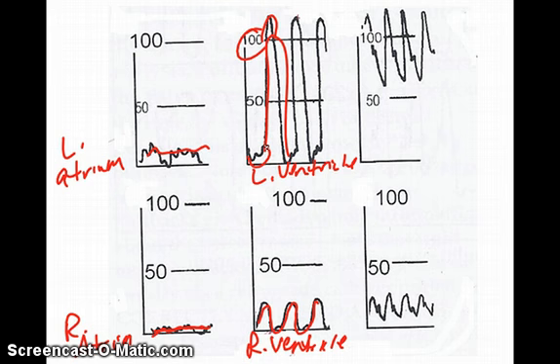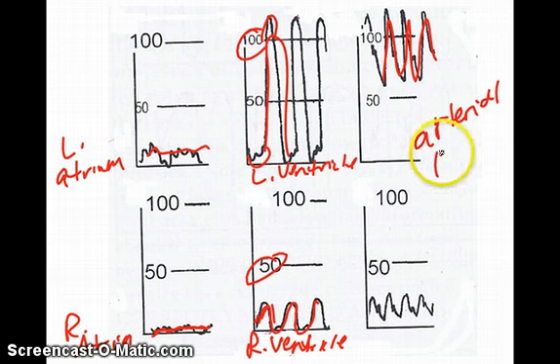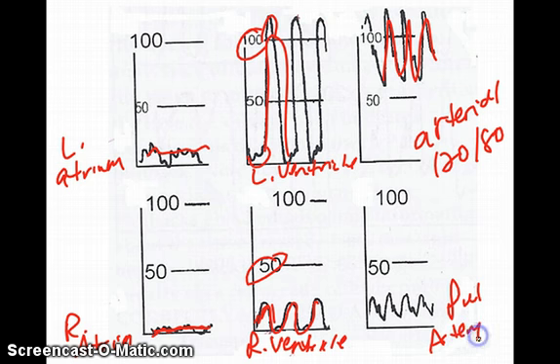The right ventricle, remember, is 25, so here's 50, so yeah, it's going about halfway. So 25 goes all the way to 0, and the EDP is about 5. Okay, and then here we've got the triangular, and it has the dicrotic notch, and it does not go all the way to 0, because remember your normal arterial pressure, so first of all, this is arterial. A normal artery pressure is 120 over 80, and then this would be pulmonary. Remember, your pulmonary artery is about 25 over 10.